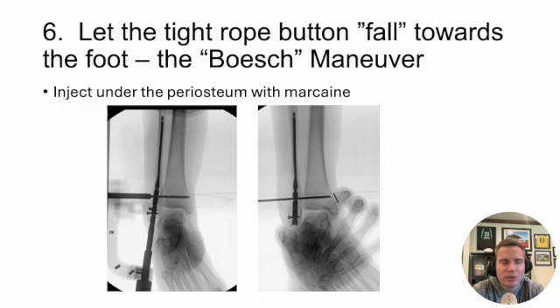Tip number six is a bonus tip — I call this the 'Boesch maneuver.' This is not original to me. If you're using a tightrope in particular, put the red tab toward the foot and let the button fall away or fall downhill — it tends to sit in a much more flush position. The other thing you can do is inject a little local anesthetic underneath the periosteum — a little Marcaine or lidocaine — to create a bubble right where the K wire comes through. I use a cannulated technique: I run a K wire across the syndesmosis, and once it gets through the medial cortex of the tibia, I meet it with an 18-gauge needle and inject just a little local underneath the periosteum. It creates a small bubble and you can let the tightrope button fall into that space.